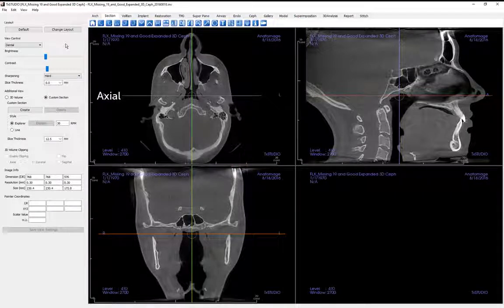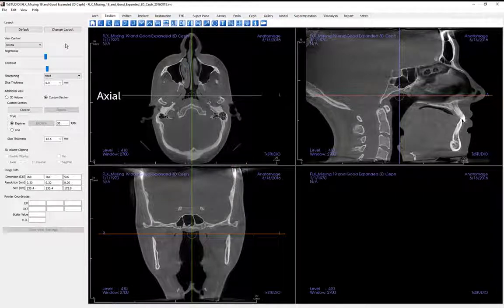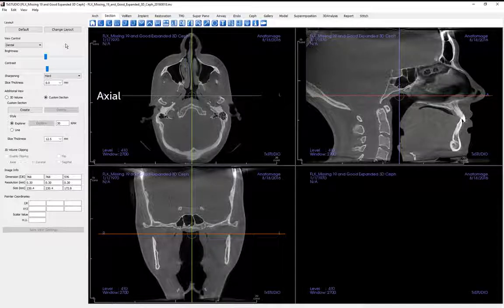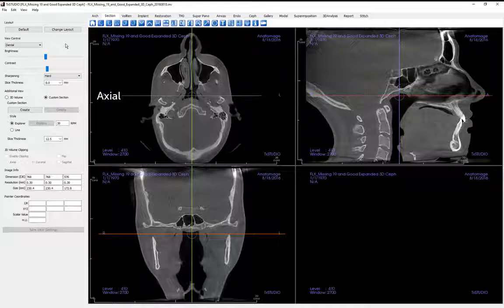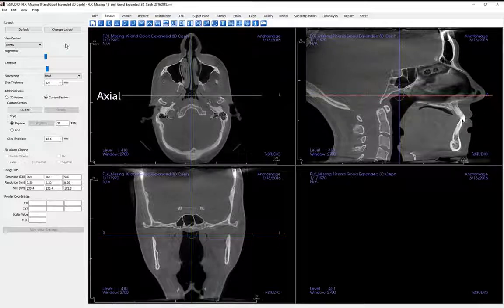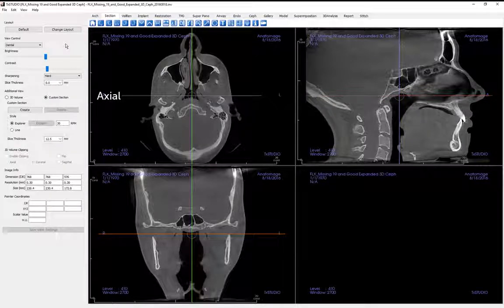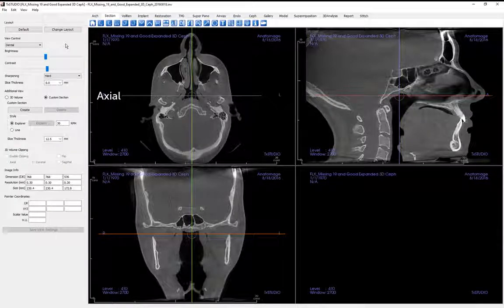The top left viewing window is the axial view. Our view of the patient is looking up from the bottom of the patient's head at a specified thin slice of the anatomy. The orientation of the patient is shown on the screen with the patient's right side on the left-hand side of the viewing window and the patient's left side on the right side of the window.